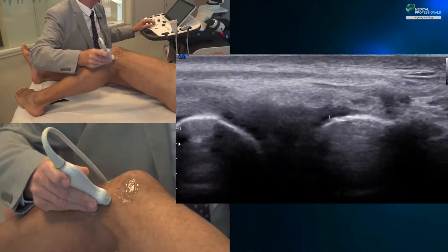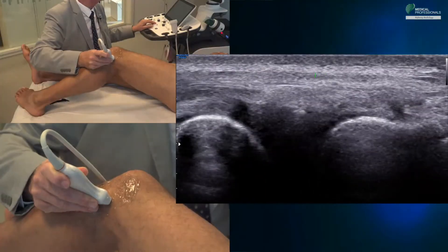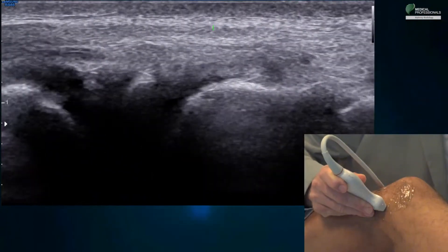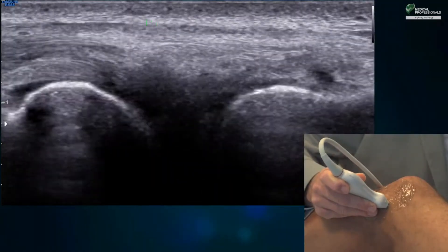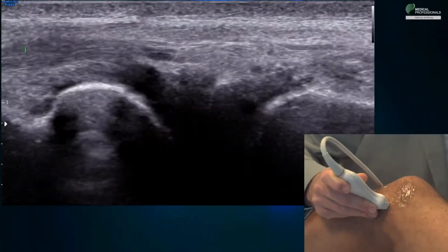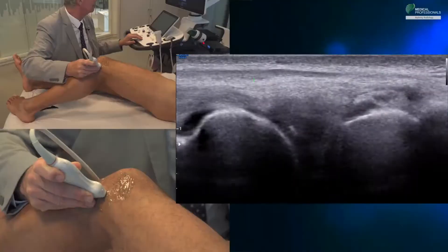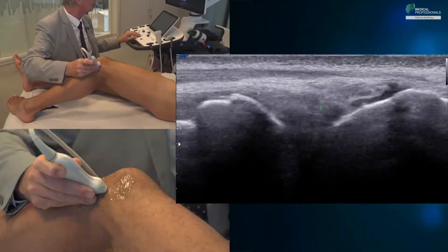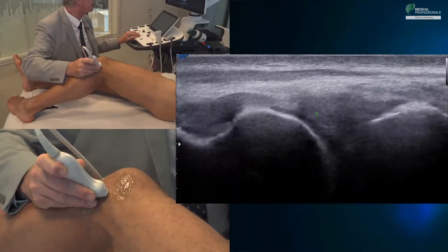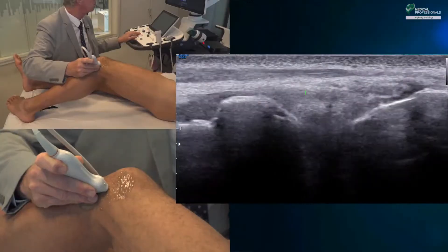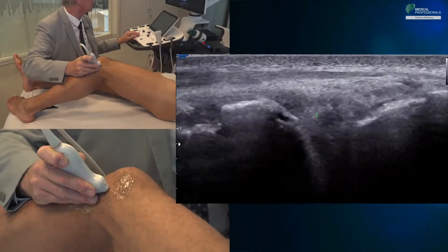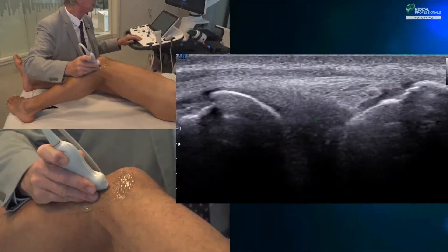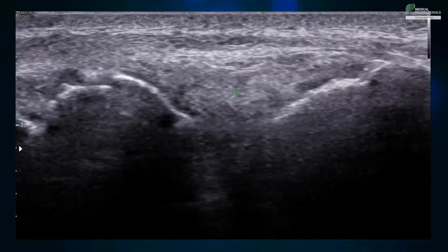This allows us to discover an important element that has been rediscovered recently: the anterolateral ligament. It is difficult to see in its normal state. It passes on the peripheral side of the external or lateral meniscus and forms a common insertion with the lateral collateral ligament, which we will see later. In this position, we also carefully examine the lateral meniscus for a small fissure, but especially for a cystic process, which most often develops anterolaterally on the periphery of the meniscus — an area also very accessible for ultrasound-guided puncture.